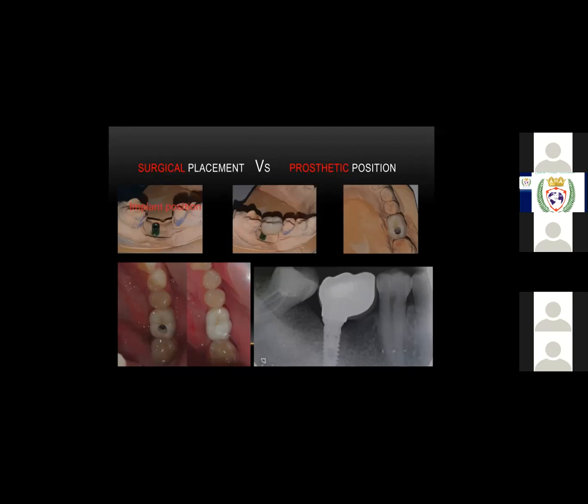The distal part is okay, you can put an implant, but connecting to an immediately implanted one is a bit of a risk, and if it fails, I will not have a backup. So I thought I'd do 3 implants and try to over-engineer the whole treatment.